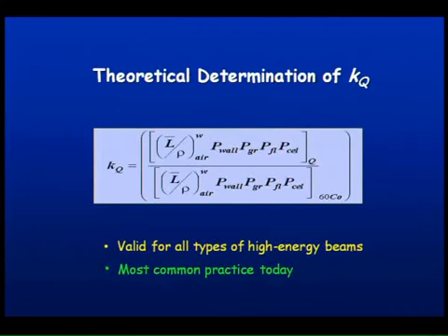So in the absence of that, the other alternative is to provide calculated values of Kq. And this is what TG51 has done, provided calculated values of Kq for many cylindrical and plane parallel chambers. Kq is given by this expression. It's a ratio, at the quality Q, the beam quality of interest, to cobalt-60, of the water-to-air stopping power ratios and the various perturbation factors.